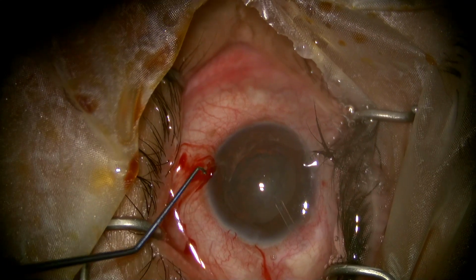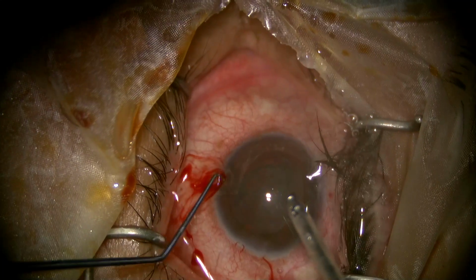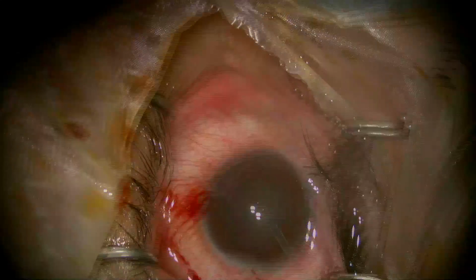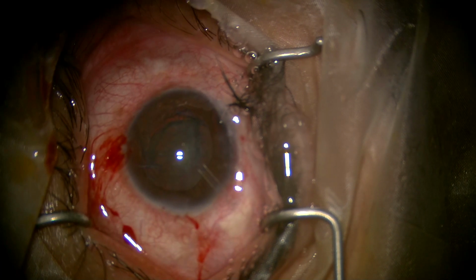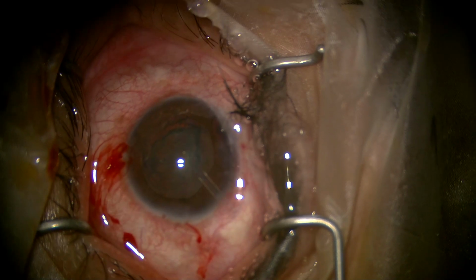Now we are using a blunt chopper with a 2.2 millimeter phaco handpiece, 2.2 millimeter needle, in an Alcon Faros phaco machine.